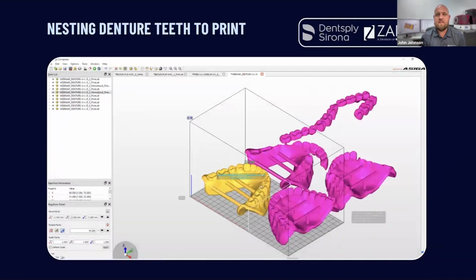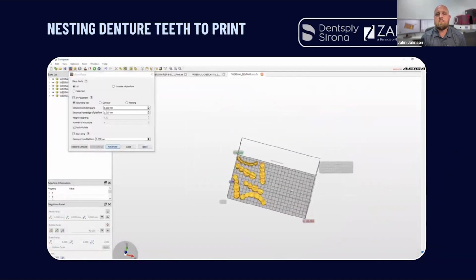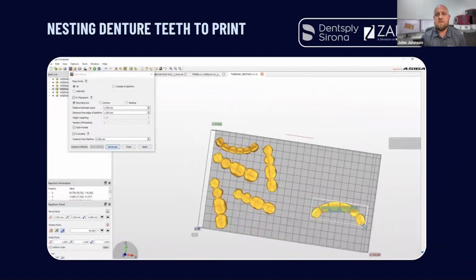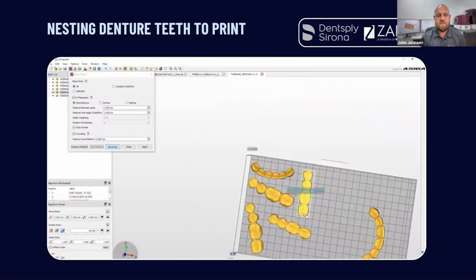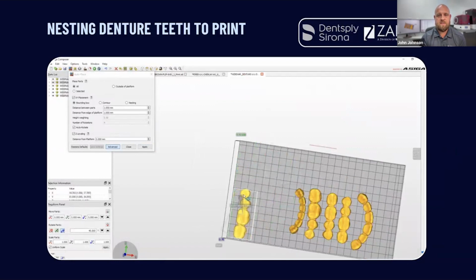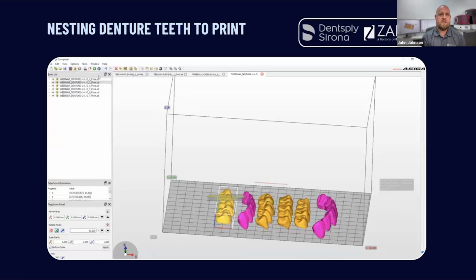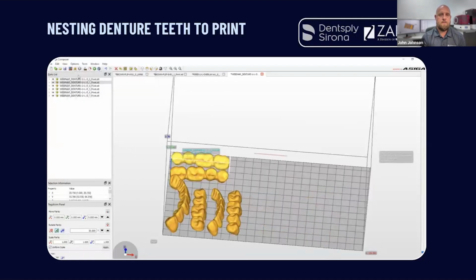So I nested the try-ins, I nested the dentures. Now I want to show you how we nest the denture teeth. This build platform is the size of the Asiga Max, if anybody was concerned with that. So I set all these teeth and I like to set them up in a direction where it's easy for me to manipulate, because I'm going to rotate all of these 20 degrees. And that gets all those supports away from the facial aspect of my teeth. And then I'll go and generate.